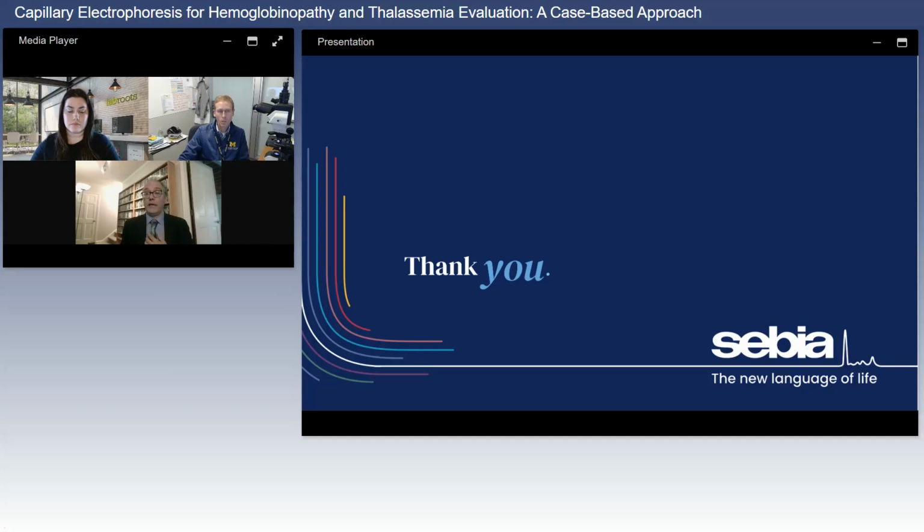As part of the supplemental resources available with that publication is a downloadable spreadsheet, which is nothing but a list of about 400 hemoglobin variants, as well as the position in which those variants are known to migrate. I know that I myself use that particular resource quite often in helping with result interpretations. So I would absolutely recommend other users look up that particular resource and download that spreadsheet.